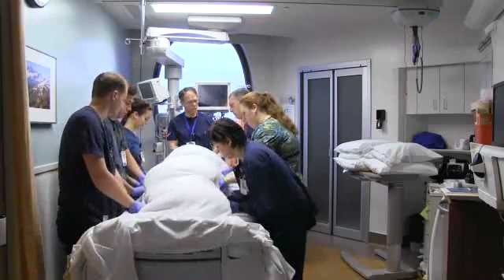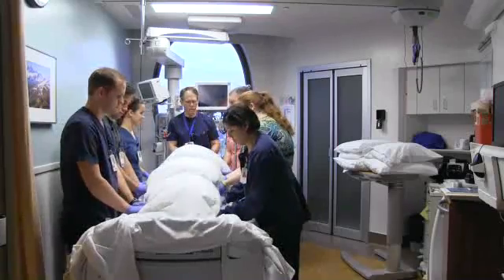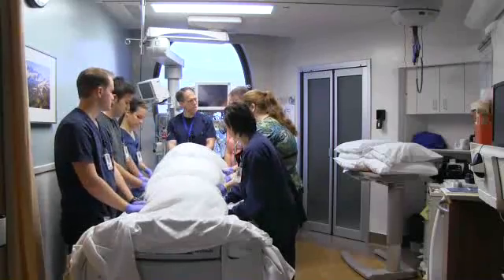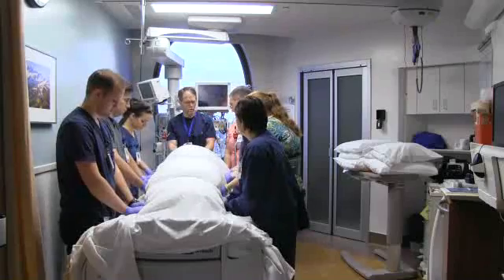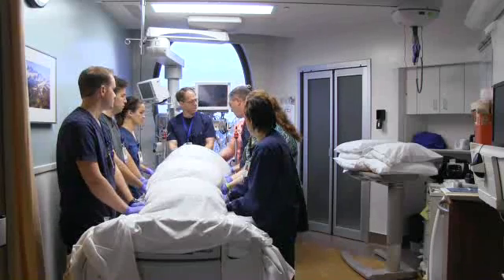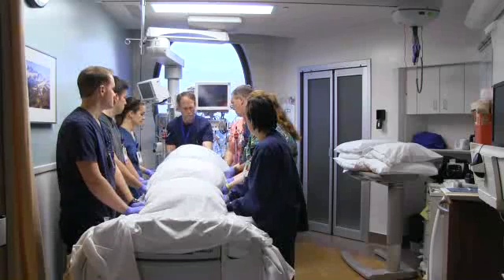While all this is happening, the RT's focus is going to be just watching the tube, making sure everything stays in place and that we're not bumping anything that shouldn't be bumped. As soon as this is done, your key person will direct things. They'll give directions based on the location of the ventilator and be very clear in those. Everything will be done on the count of the RT who's at the head of the bed, and the RT will be in charge of holding the patient's head.